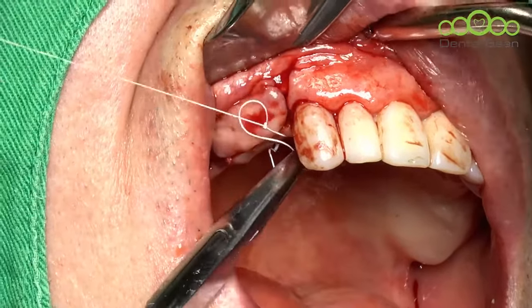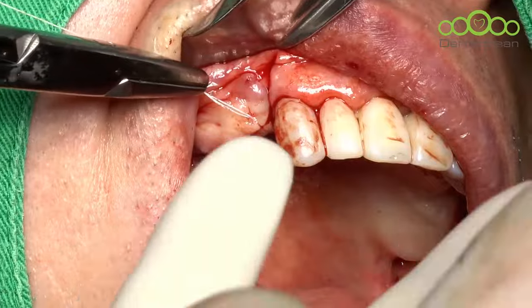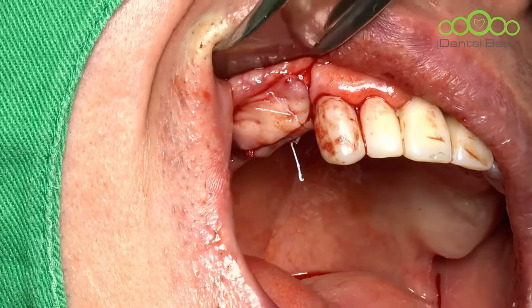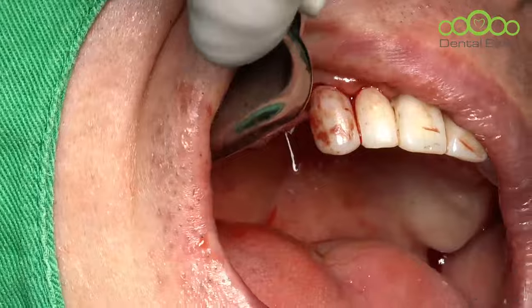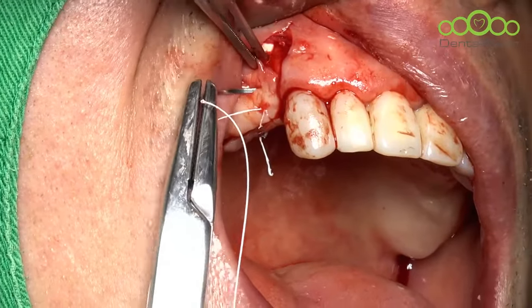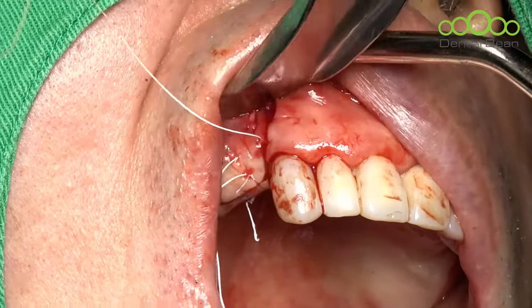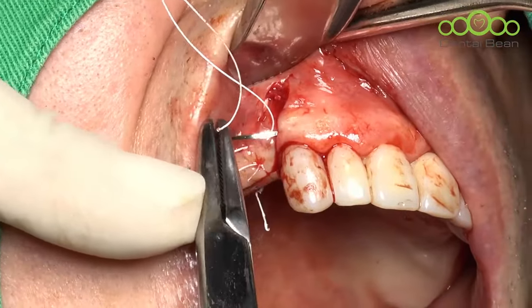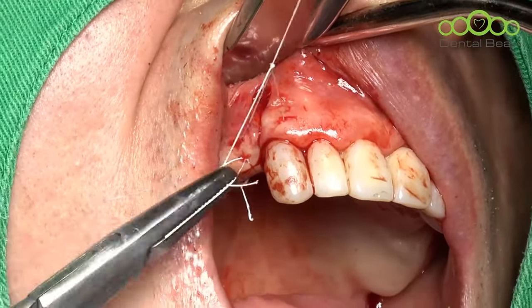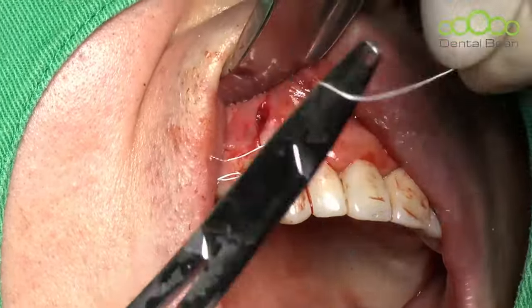No more questions? Is there any question? Yeah, from a Korean dentist, here is a question. When I do ridge split, I didn't make a vertical osteotomy at the anterior. He asked, is there any experience of buccal plate fracture? Yes, I have. In the classical ridge splitting technique, we usually make a crestal osteotomy and two vertical osteotomies, and then try chiseling. During that procedure, sometimes we experience buccal plate fracture.